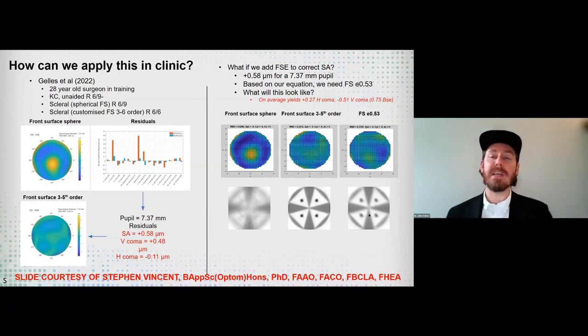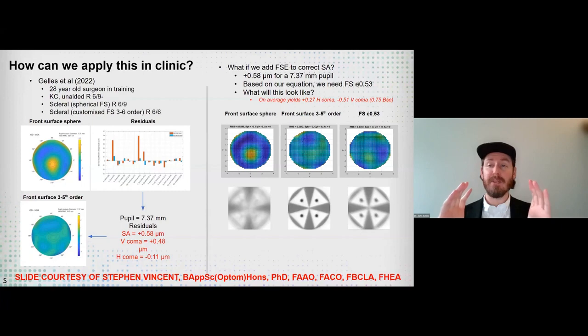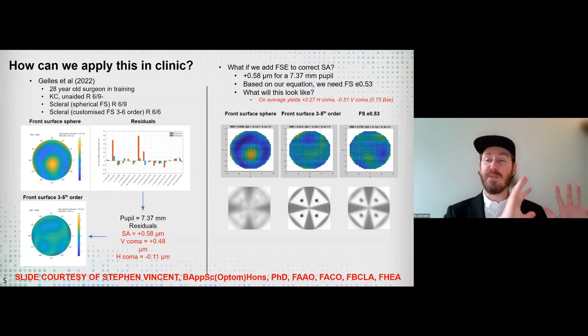So what we may see is that for individuals with lenses that aren't able to be totally stable on the eye, maybe having a more optimized eccentricity is a good way to go for those individuals versus going fully into full higher order aberration correction. And we may want to reserve the full higher order aberration correction to those who have very, very perfectly stable lenses.